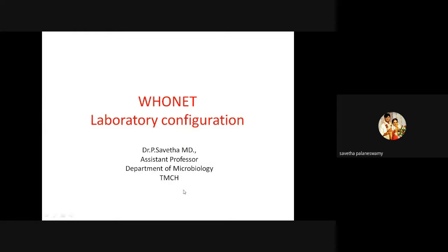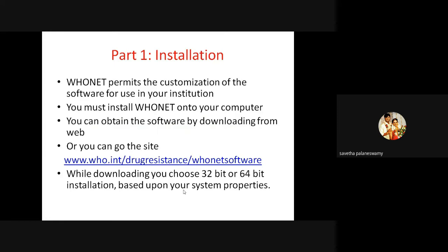So, from the introduction part by Kanan sir, he has already told this is a crucial step, the laboratory configuration. So, lab configuration is very important. If you go wrong in this part, then your entire part will go wrong. So, kindly pay attention and please listen to this and we will do a good installation. Okay. So first you want to do the installation. So how are we going to do the installation?